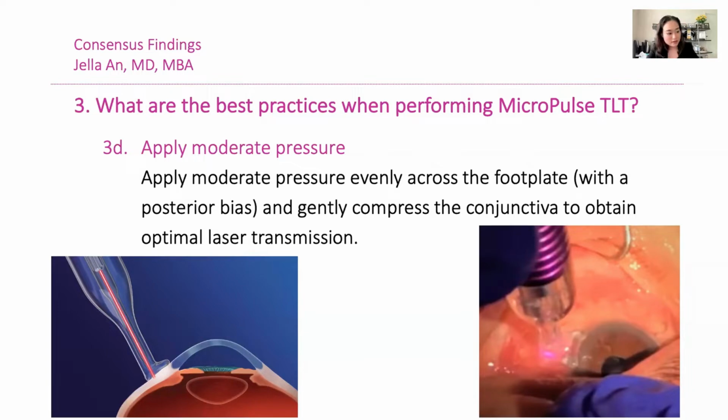So, as everyone talked about, the MicroPulse is really significantly safer than traditional CPC, but only with the proper technique and adequate dosage. Those two are really paramount for this technology to be effective and free of any complication. But unfortunately, existing literature is really limited in this regard due to variability of surgeon techniques and variable dosage that they use, and often not consistently reported.